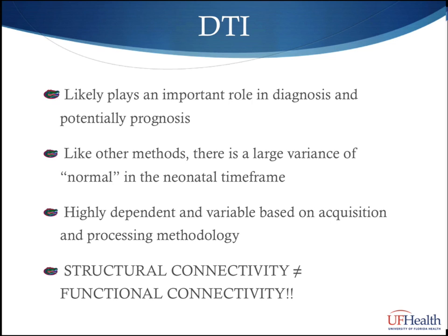Standardization is a hot area of research, and hopefully within the coming years we will see better standard equivalence across machines and across vendors, but this is very difficult to achieve. The last point I want to make with DTI is something that we will revisit shortly with functional MRI, and that is that structural connectivity does not equal functional connectivity. What I mean by this is that identifying anatomic connections between two areas does not necessarily imply there's a functional connectivity between those areas. This becomes particularly true in neonates and young children, which we will discuss when we talk about functional MRI.